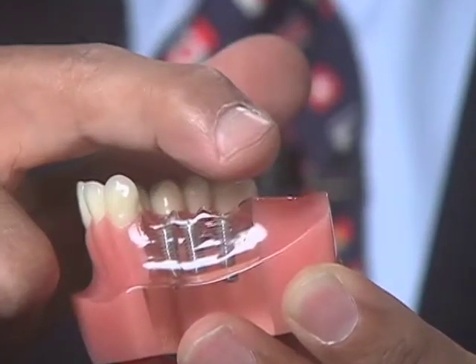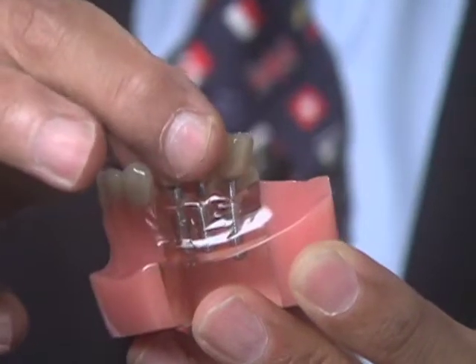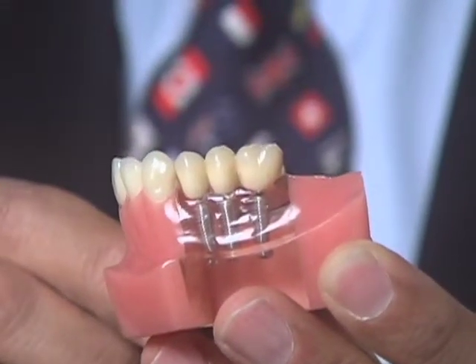Dental implant is a replacement of the root of a missing tooth. A dental implant is a metal screw which is inserted into the bone. In order for this to be successful, you need to have bone. We usually prepare the bed with either bone grafts or other means to make it acceptable for the implant. So the implant is a metal screw which is screwed into the bone. It is allowed to integrate with the bone, and that is known as osseointegration. Once it has integrated with the bone, the implant is then loaded, and when we load it, we actually place the teeth for which these implants were made in the bone.